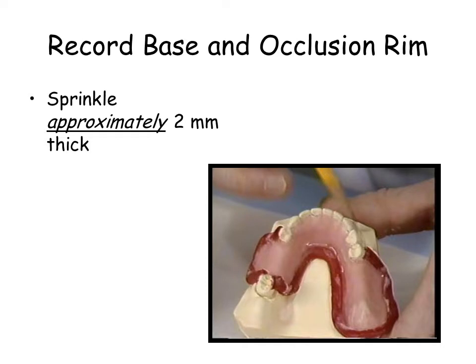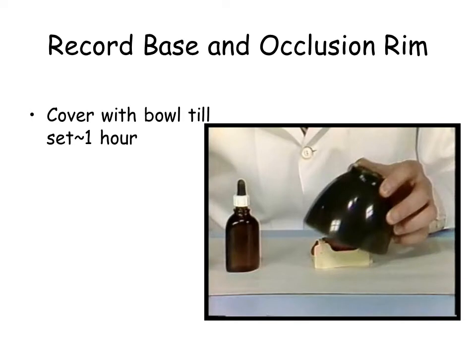Cover the wet base for 1 hour with the rubber bowl to ensure thorough curing. It is advised to let the base set overnight before removing from the cast. The base should remain on the cast when not in use.